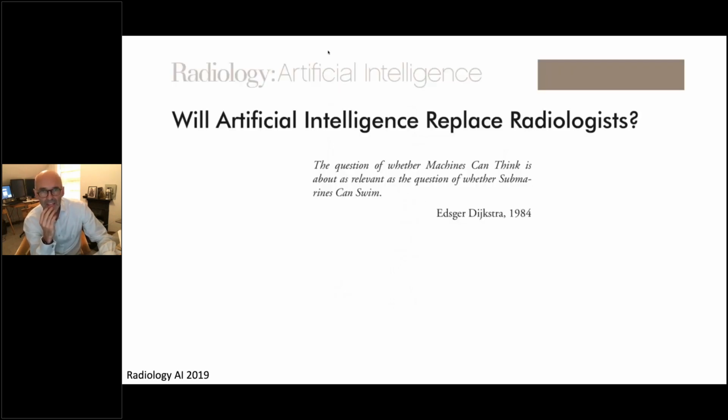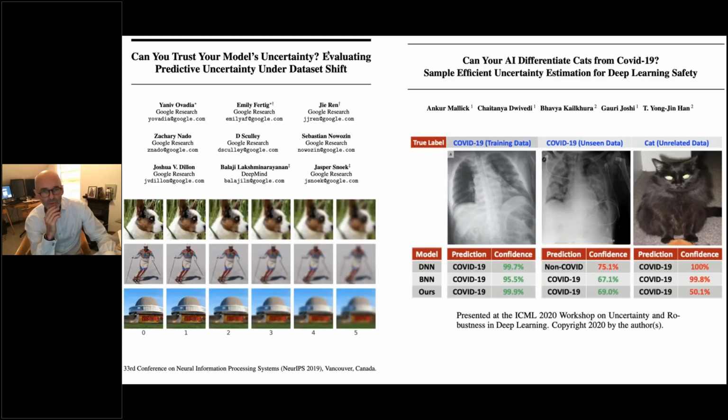So I think we start to think about whether, as discussed before, radiologists and pathologists aren't going to be replaced by these scanners or this software, at least not yet. We can do things that the algorithms find hard. On the left is a dog, a ski, a building, and the image quality gets worse and worse, but you still know what those are, whereas the algorithm would struggle on the far right because it needs certain quality imaging.